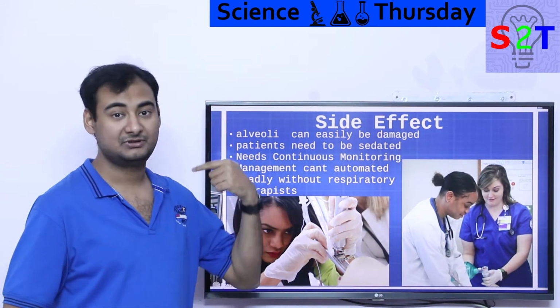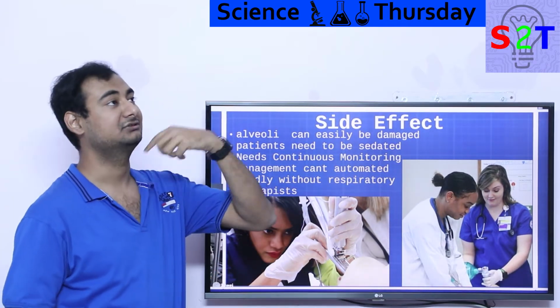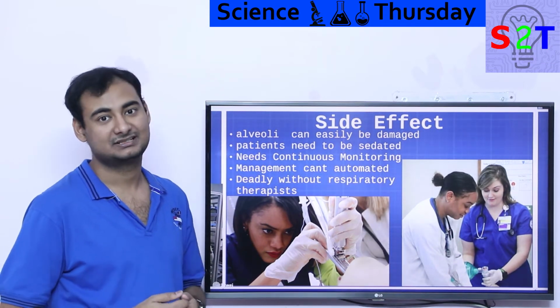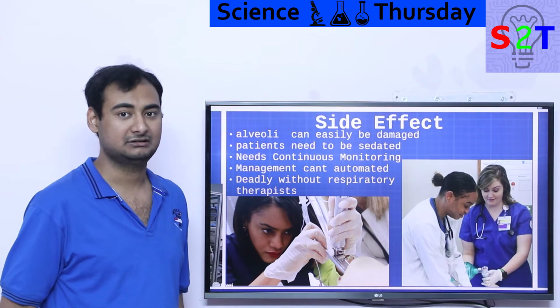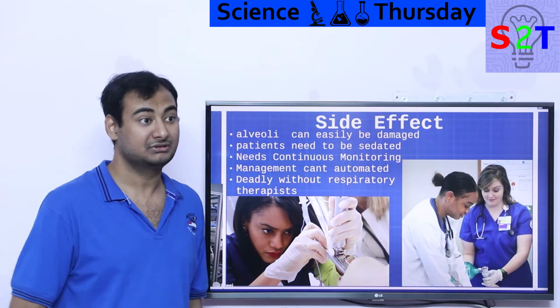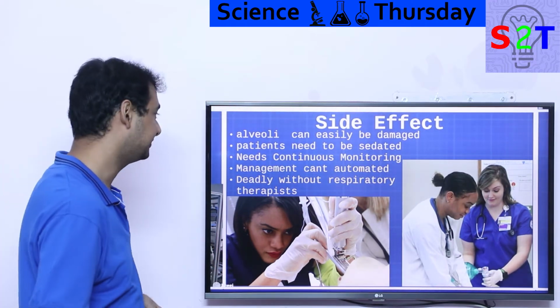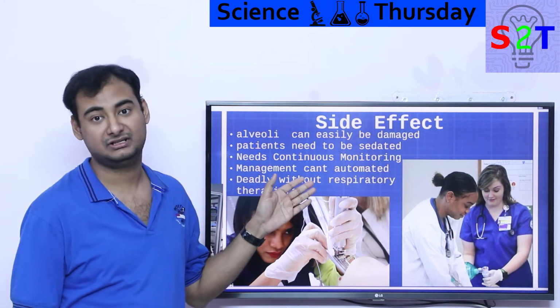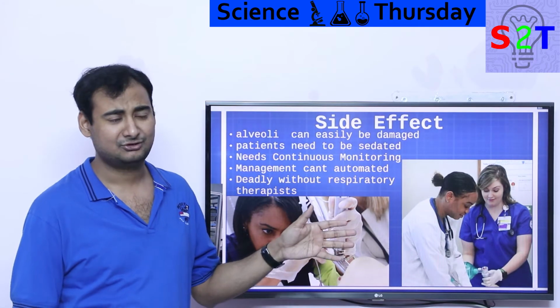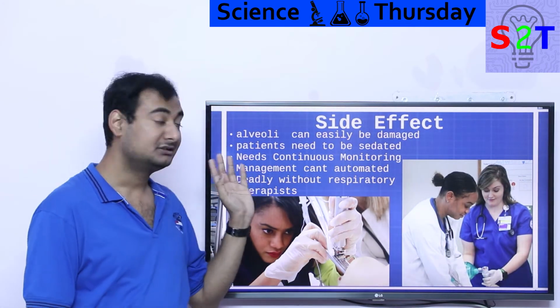Now, patients need to be sedated because you literally have this thing going directly through your vocal tube, like they remove the flap and then directly have that. The person cannot be awake. It would be like they are suffocating. If people come awake during that time, because you don't want to sedate them for that long, you generally put them on heavy sleep medication, but for some reason they start to wake up, they'll try to pull it out because it feels like suffocation. So sedation is also an issue. Again, if you have to sedate someone for 1 day, no problem, but you have to sedate them for 2 weeks, which is needed in this pandemic. Yeah, that's another danger.